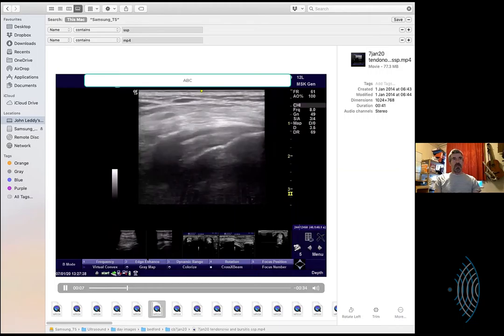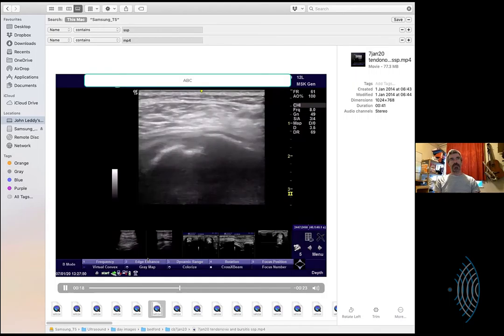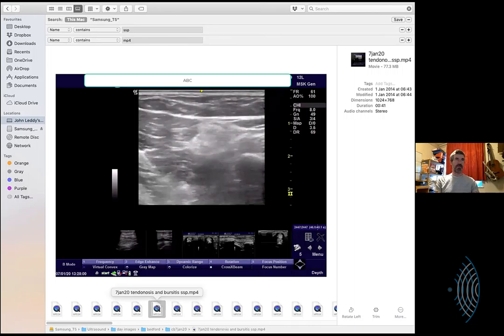What's this one? What does the title say? Oh, supraspinatus. Oh, this is just tendinosis and bursitis. I'm sure you have seen this one before. Is there a way, John, that you use to differentiate hypertrophic SASD and actual fluid, other than just the brightness of it?